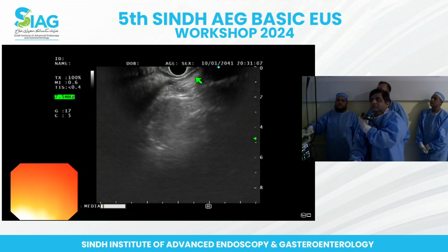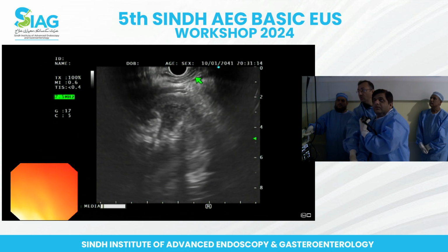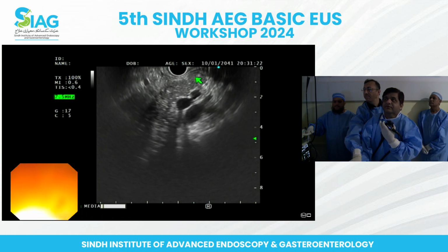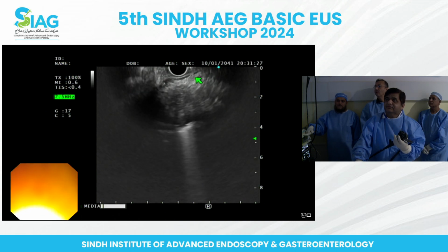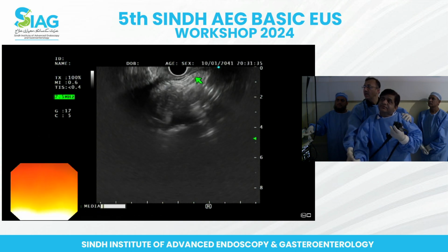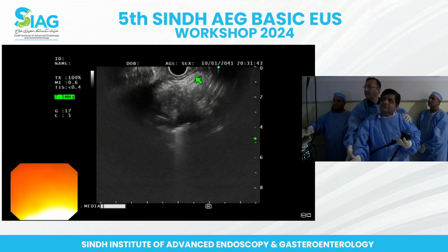Push along the aorta, just a jiggle movement, so that you keep the aorta right underneath your transducer. Slide along the top of the transducer. There you go. And right here we have the pancreas. Now you're going counterclockwise? Yes, sir. Again counterclockwise, you're not supposed to push. This is the pancreatic duct. So the pancreatic duct is right there underneath your transducer. Keep it there.